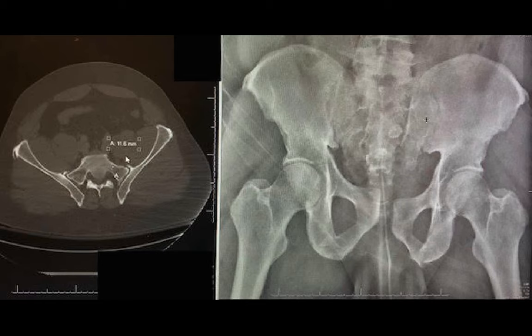The other thing to consider here is that this pelvis is dysmorphic. Dr. Chip Routt talks a lot about the various components of pelvic dysmorphism, and I'm not going to go through all of them, but here the one that you can see the most is the very acute slope of the sacral ala. So this really makes your OFP, the osseous fixation pathway through S1, a pretty tight squeeze.